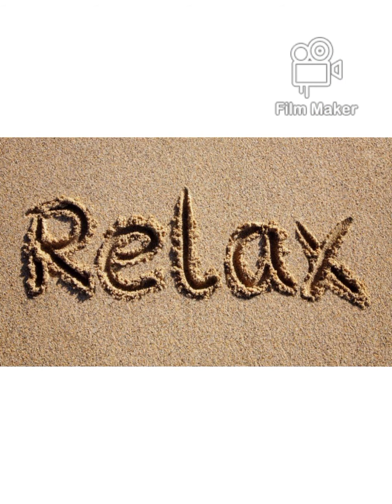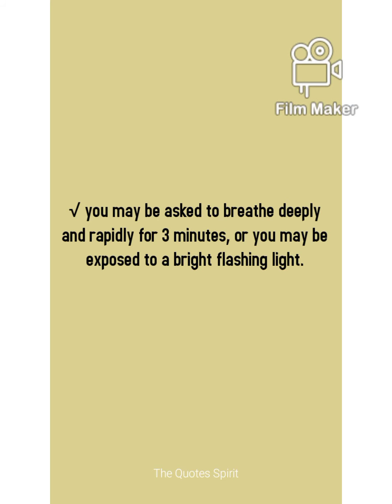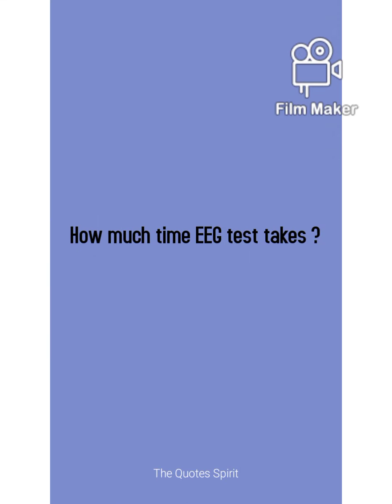And also, you will be asked to close your eyes, relax, and be still with no movements while the test is being done. You will need to remain still throughout the test. You may be asked to breathe deeply and rapidly for 3 minutes continuously, or you may be exposed to a bright flashing light at the conclusion of the test for 3 minutes.